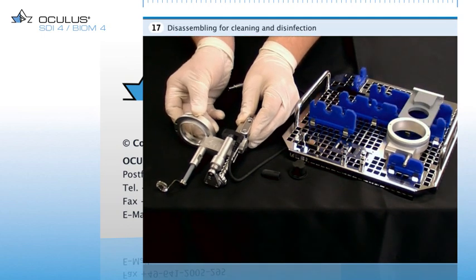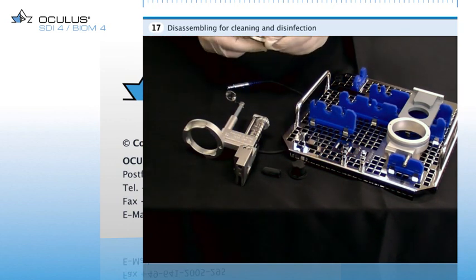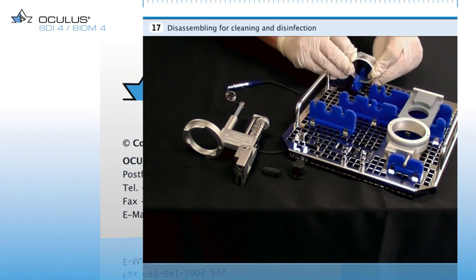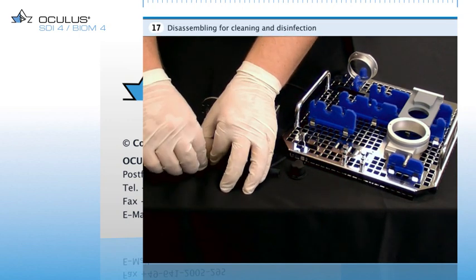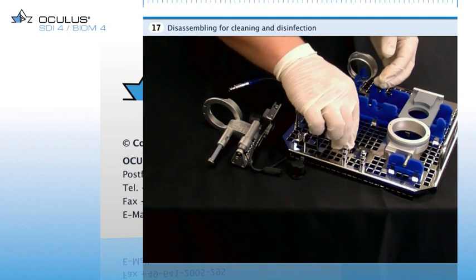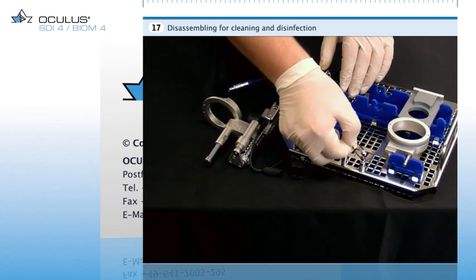Release the reduction lens by turning it counter-clockwise in the lens holder. Place the lens on its designated mount on the sterilization tray. Draw the Biome wide-field front lens forward off the lens holder and place it on one of the mounts of the sterilization tray. Pull the drive belt off the guide rollers of the Biome and place it on its mount on the sterile insert.